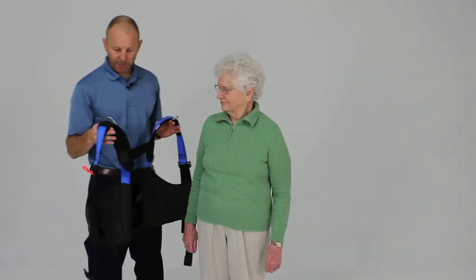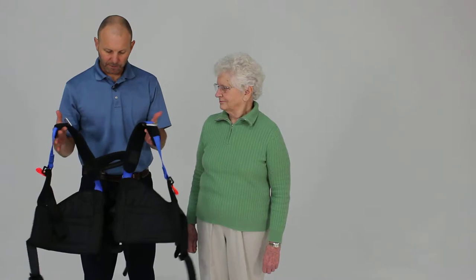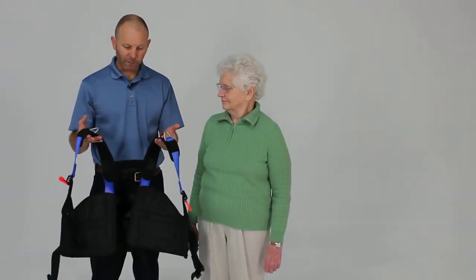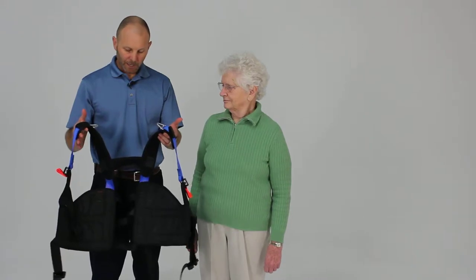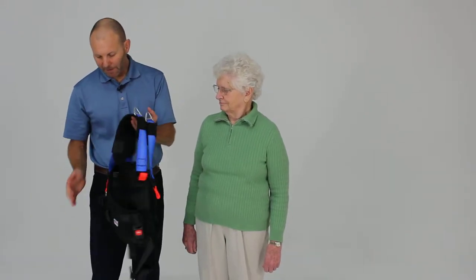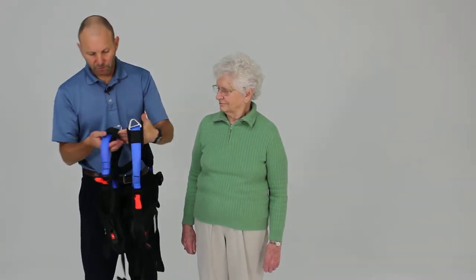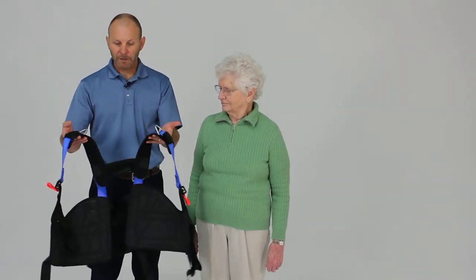I'd like to cover the standing application of the unloading harness. This harness would be used for situations where you're going to need to provide more body weight support for the patient. It has adjustments both on the back of the harness and on the front of the harness, so you can adjust to multiple sizes and also accommodate different body shapes.